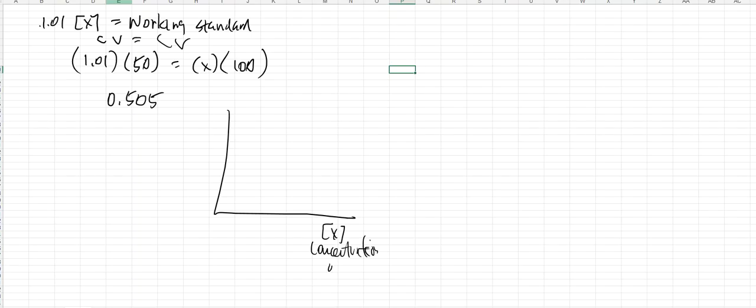This time it is in percentage, but it could be in molarity, parts per million, percent by volume, percent by weight. I mean, the list just goes on and on. There are so many different ways to report concentrations in laboratory procedures that the x-axis can be multiple different units. But generally speaking, that x-axis needs to be your concentration.